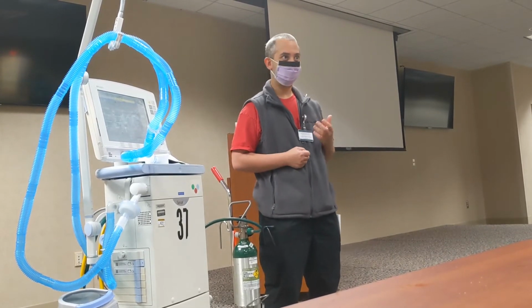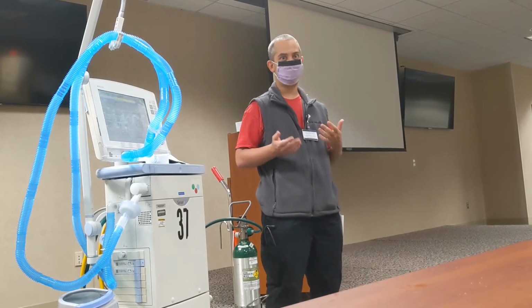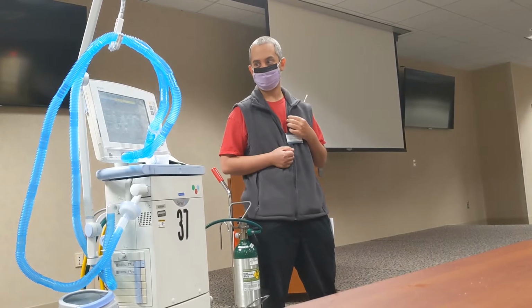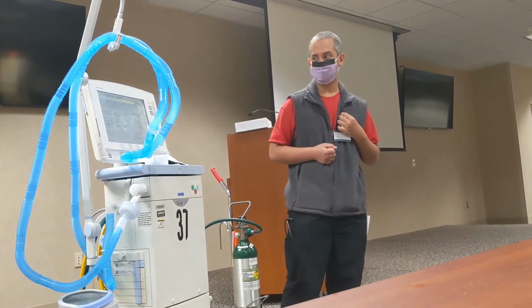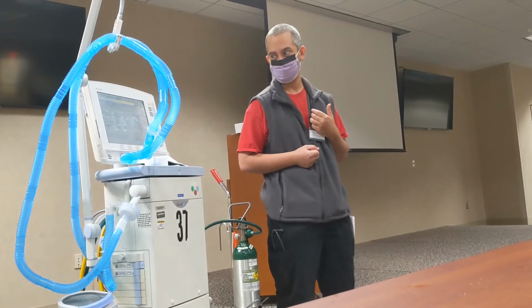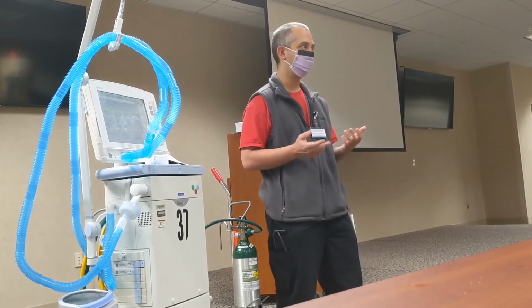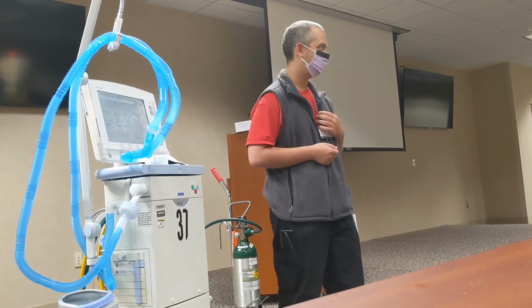So like I mentioned, pretty much the physician's going to want to go into it kind of as rescue therapy a lot of times. So there's a few different things that we set on here. Easy one is FiO2, always going to start at 100%.